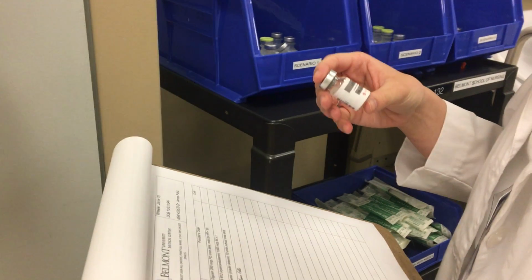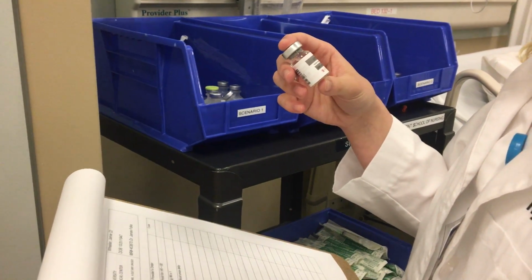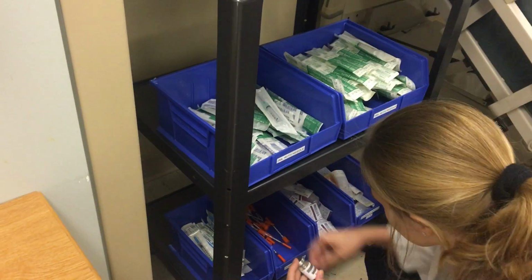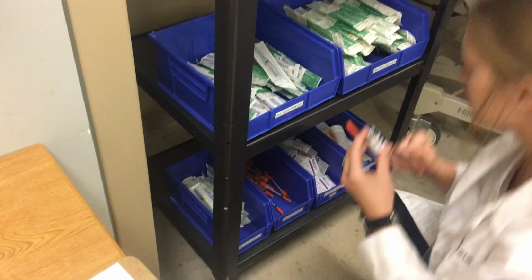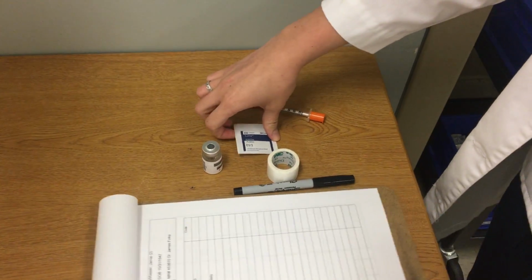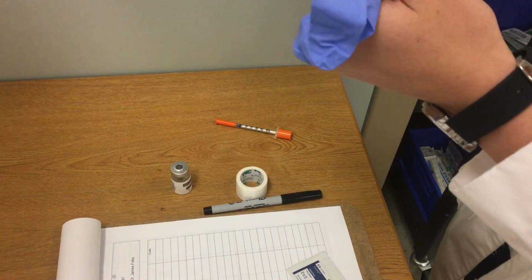So this is not expired and it is 100 units per ml and I need 10 units. So I am going to grab my insulin and I've got some alcohol pads and I'm going to go ahead and administer that here.